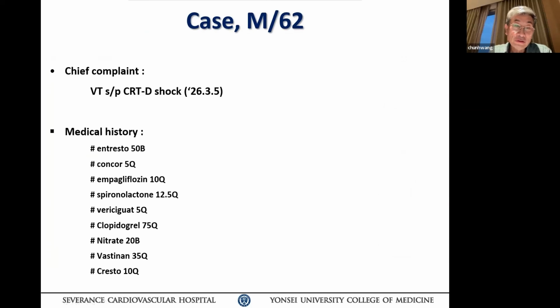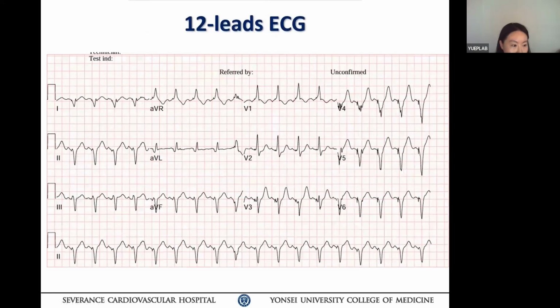I have a last question for you. Can you go back to that sinus rhythm ECG? Is the device working well, guys? What's happening with this device? It's just fair curiosity. What do you think? This is a CRTD by BiV pacing. Since the V pacing is predominantly LV based because V1 is positive, LV pacing or LV timing is early. Be careful what you say. Maybe the LV timing, LV offset is early.